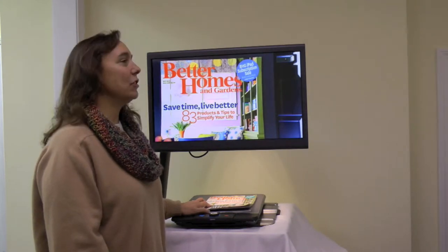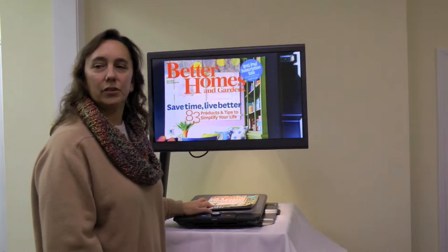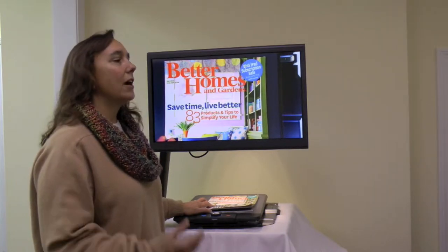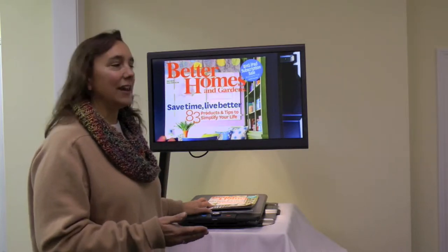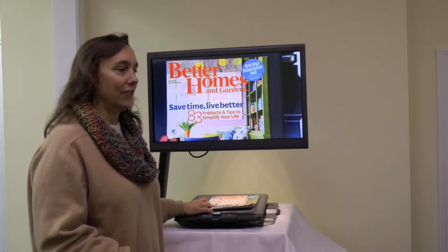Hi, it's Tracy again, and I'm showing you in continuation of our series of how to use your Clearview C with speech — how to read a magazine. And again, it's all pretty self-explanatory and simple, which is nice.